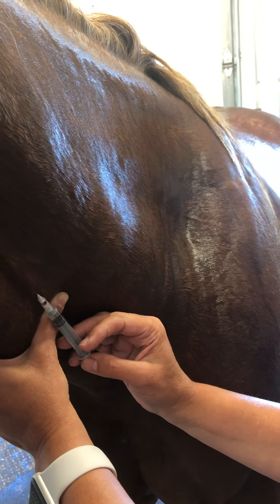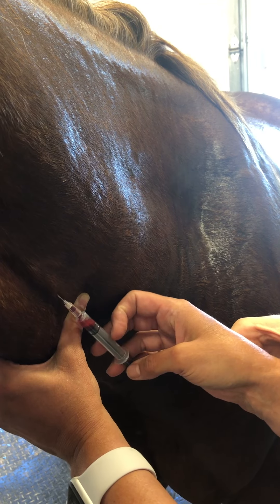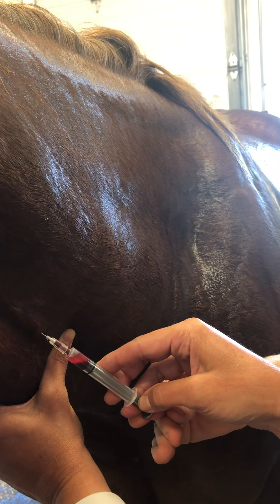Pull back and go — wait, wait. I want you more in. I don't want to be questioning whether or not this drug is in this horse. Pull back and go more that way.